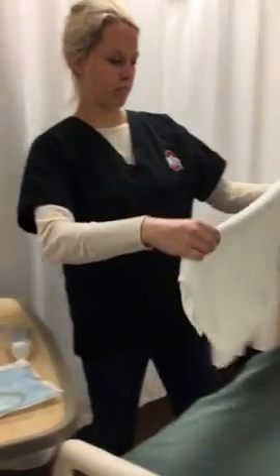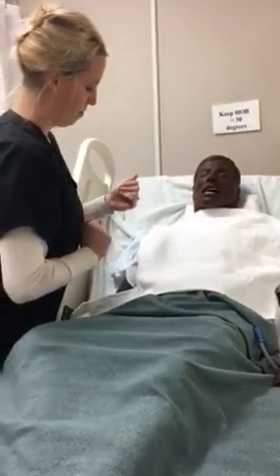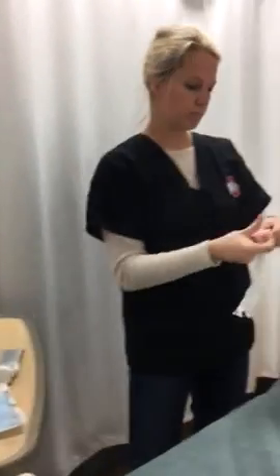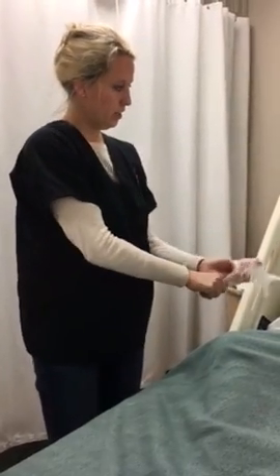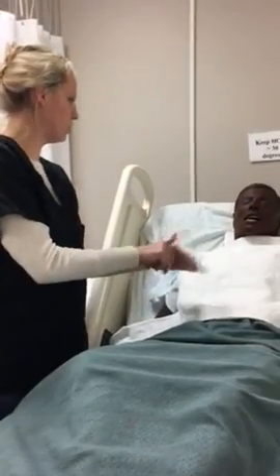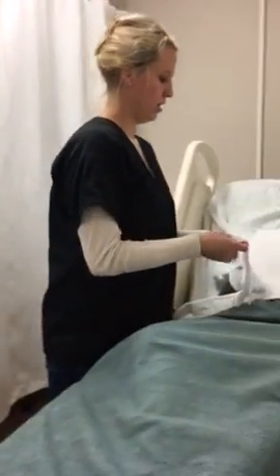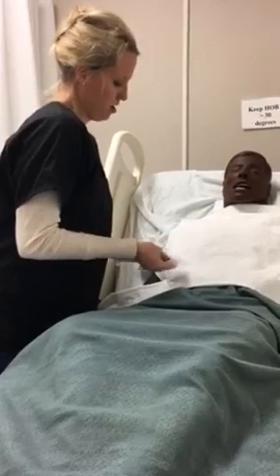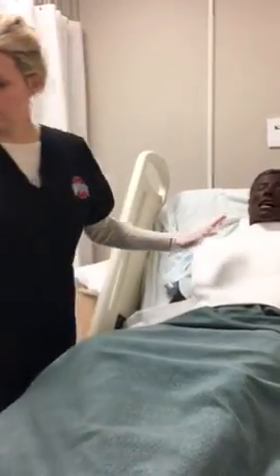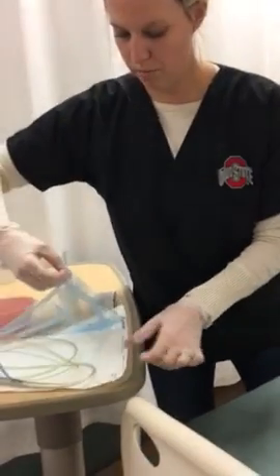So I'm going to put this down in front of the patient first, just in case anything does come up. Some hand hygiene. Okay, put on a fresh pair of gloves. All right, Mr. Templeton, so what's going to happen is I'm going to put a tube through your nose, and you might start to gag a little bit, and when that happens, I'll give you a minute, and then I'm going to have you drink some water and sit forward, and then I'm going to advance the tube forward, okay? So I'll give you your water. Open my tubing. I have everything.